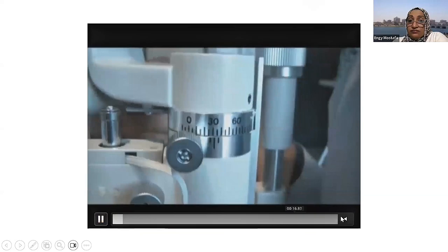Like here, these are very, very minute cells going through. And let's see, how do we do it? So this is the optic section, the normal optic section. We dim the room, and then we decrease the slit beam totally, and we make the pupil our background. We need a jet black background to see the particles. And here you can see the particles. This is a high magnification.